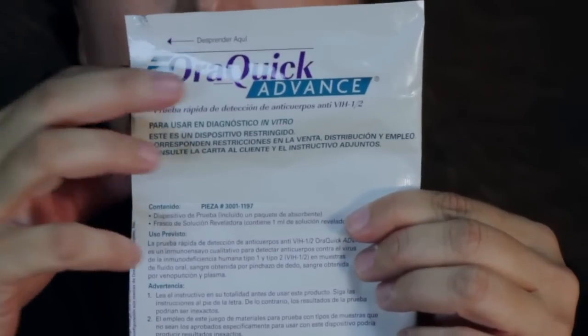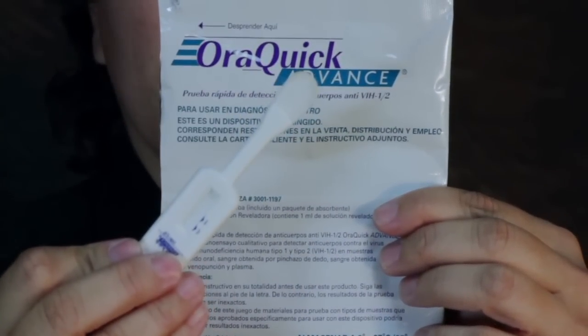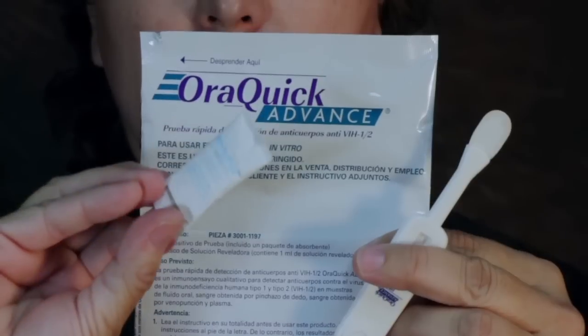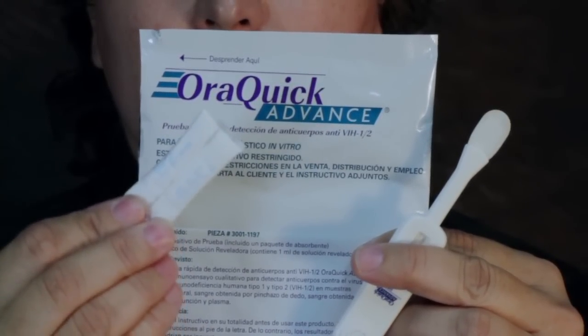Stage 1: Collecting the test sample. Have the person being tested open the package and remove the test device from its pouch. Do not allow the person to touch the flat pad. Make sure a moisture absorbent packet was included inside the test package. If no packet is present, discard the device and obtain a new test pouch.